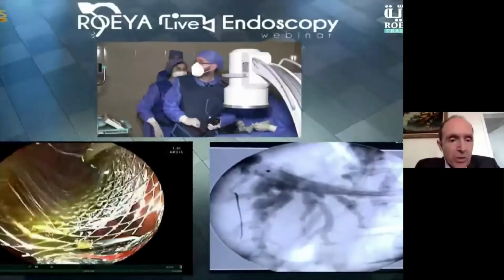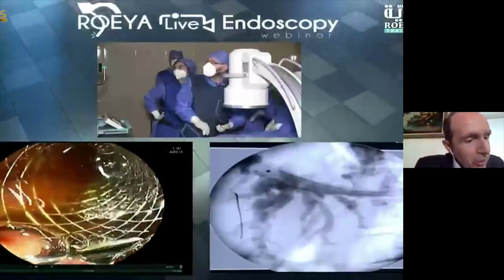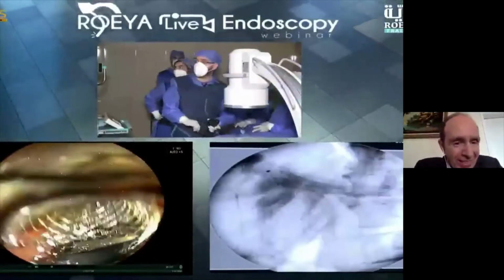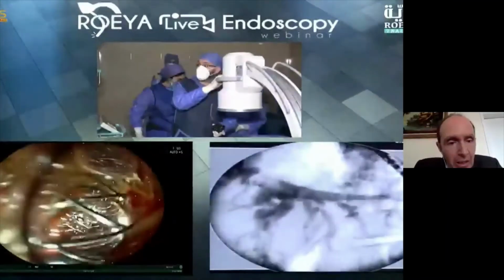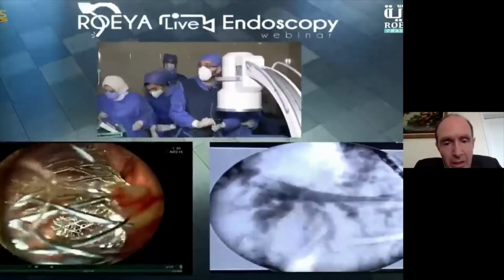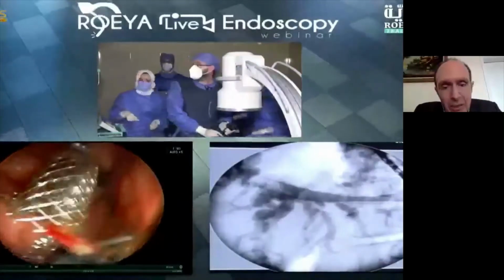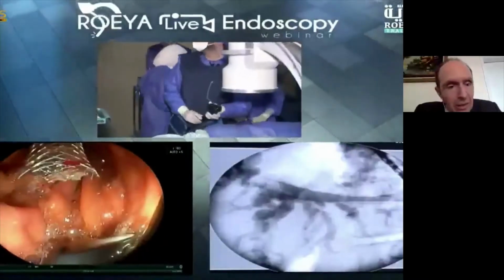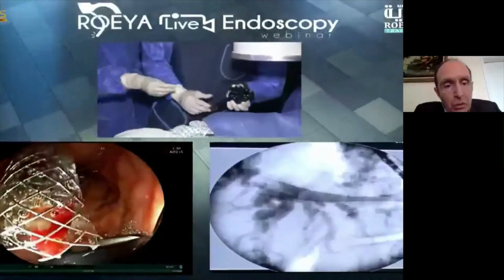Very nice demonstration. Congratulations, Doctor. Now we can see adequate bile drain, and we can see the fluoroscopic candy sign of the EUS drainage. We can see the stent inserted in the left side, and we can see narrowing at the site of the puncture of the flap with a good drainage inside the stomach.